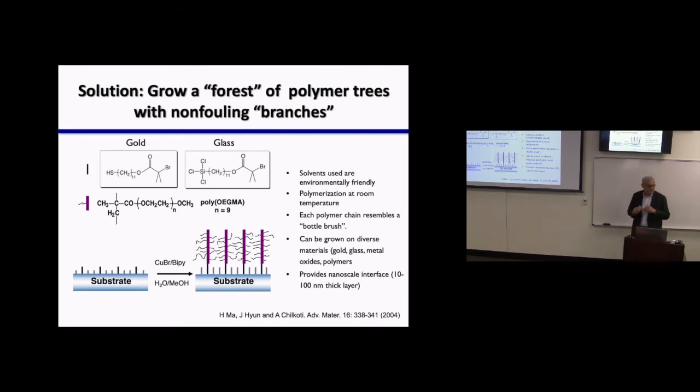The same thing happens on a surface. When you put PEG on a surface, what you're really doing, which is the same thing that happens in the body, you're preventing proteins from binding to whatever PEG is attached to, whether it's a protein or a surface. So if I attach PEG to a surface, I can reduce protein adsorption. This was known from the mid-1980s, and people then spent 20 years trying to figure out how to really make it work well.